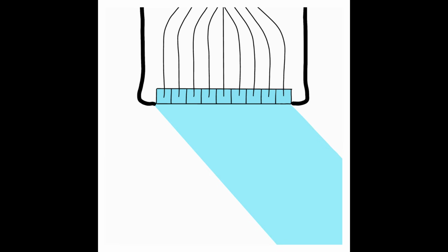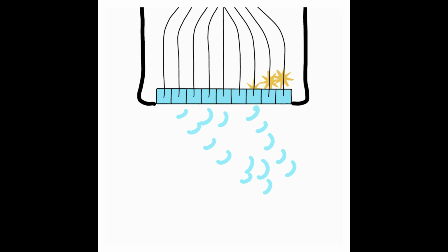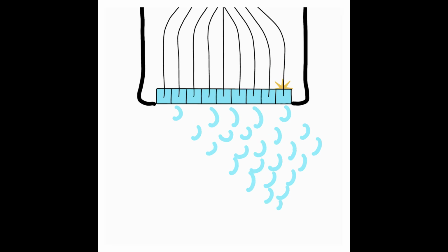Compare that then to the beam that faces the other direction. If our leftmost crystal is activated first, again, we have a slope, so we are going to have a steer. Those wavelets again are going to interact with one another, causing the beam to steer to the right.